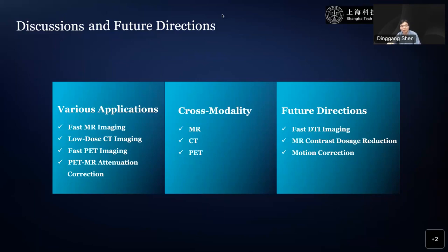And of course, the main idea there is that we are not only relying on the deep learning algorithm. We also integrate compressed sensing. If we use a deep learning algorithm, we do see in the results that sometimes it creates some artifacts in the reconstructed image, but we assume that using compressed sensing with very good mathematical formulations and constraints, you can reduce artifacts, for example, those introduced by the deep learning algorithm. So this is the main idea.